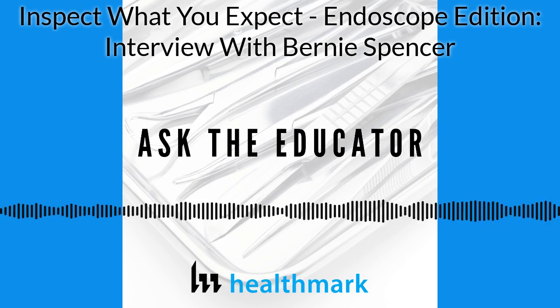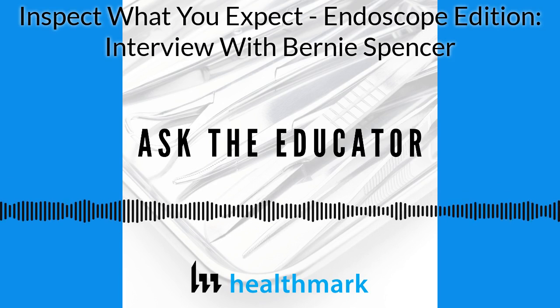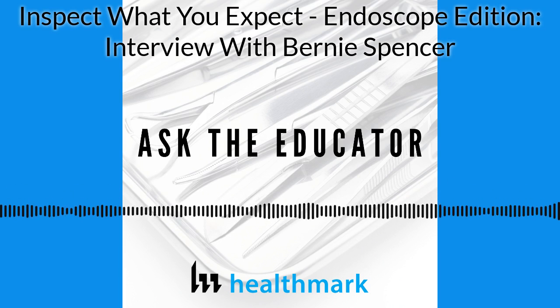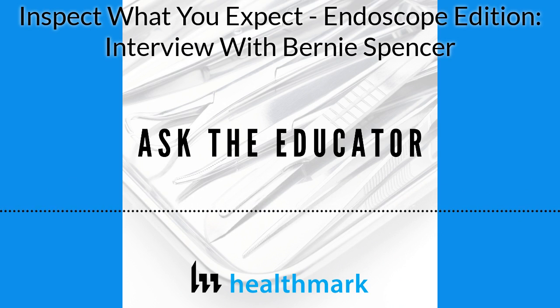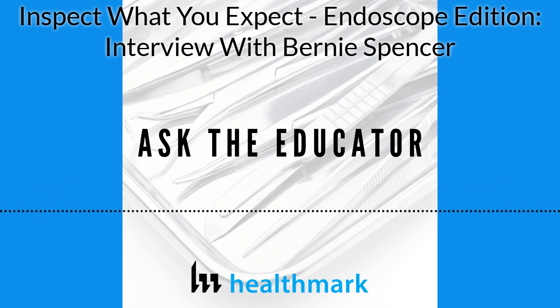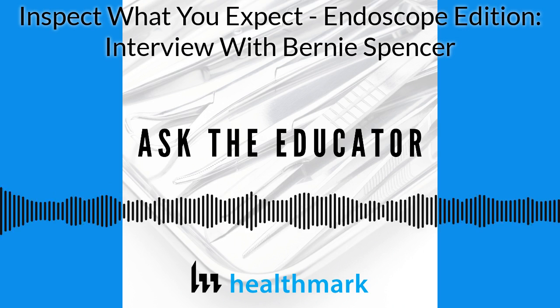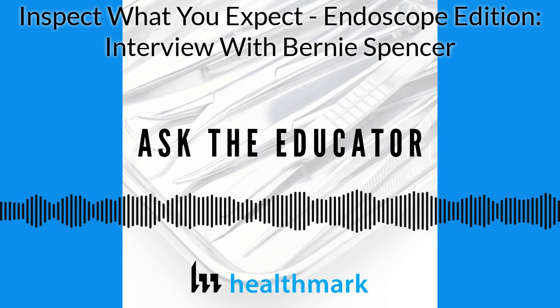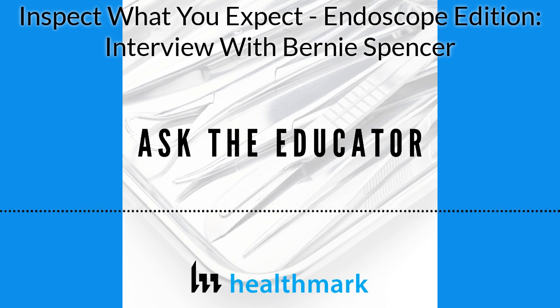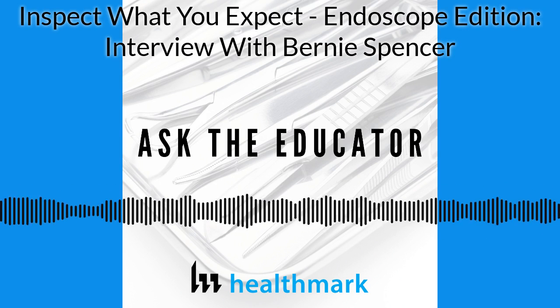And just really tightening up our process. So in conclusion, revisiting the principles and the concept that I mentioned earlier, now I have another way to inspect what I was expecting. In my experience, again, the cleaning brush in some instances was not adequately cleaning the channel. Not all scopes are contaminated equally during a patient procedure, and all debris are not adequately moved by just brushing. It's not enough to do your best. You must know what to do and then do your best.